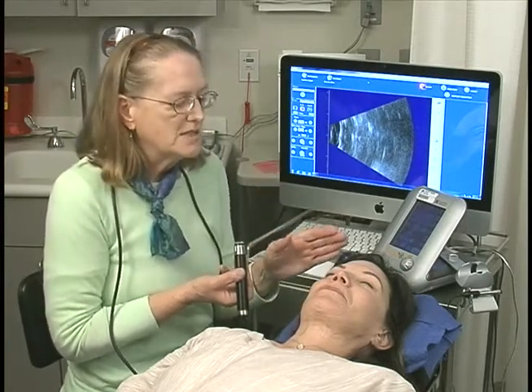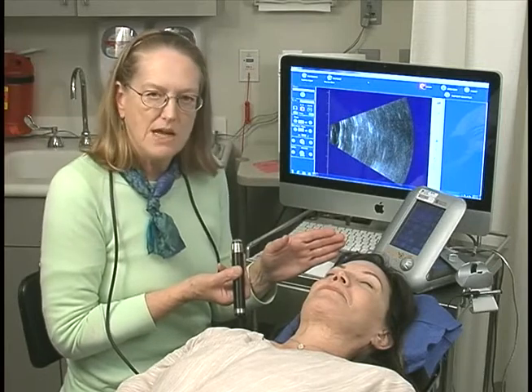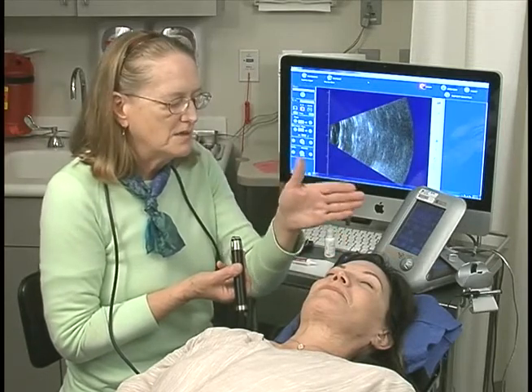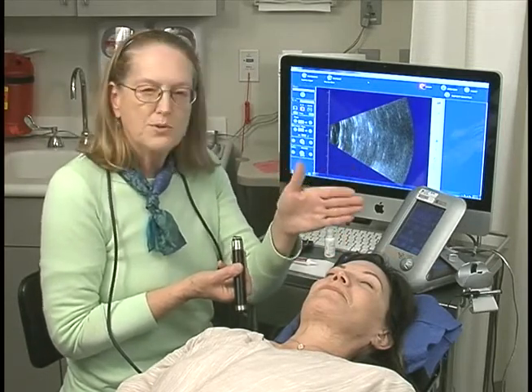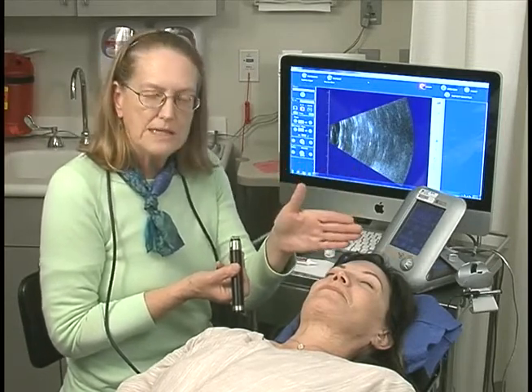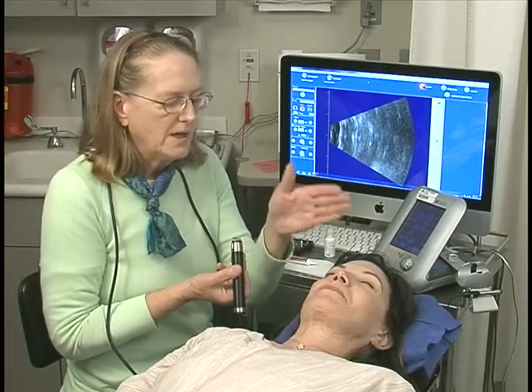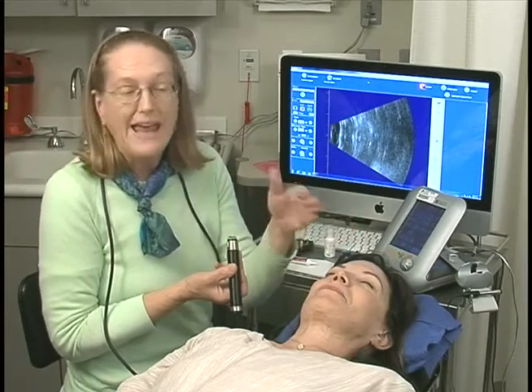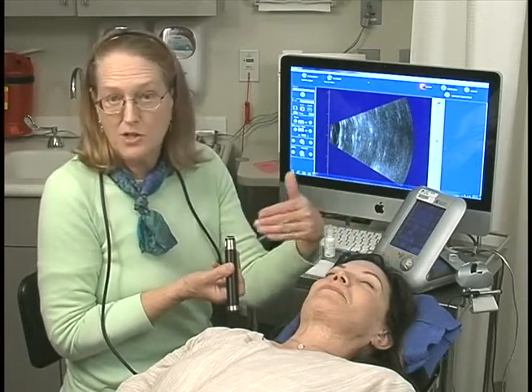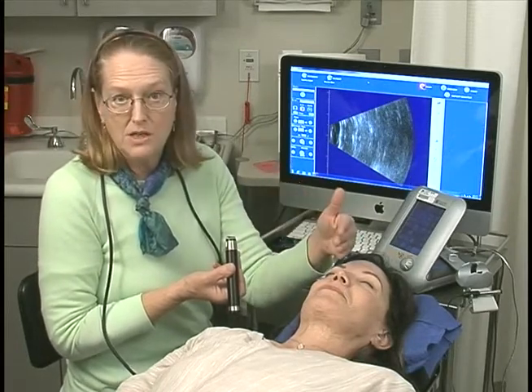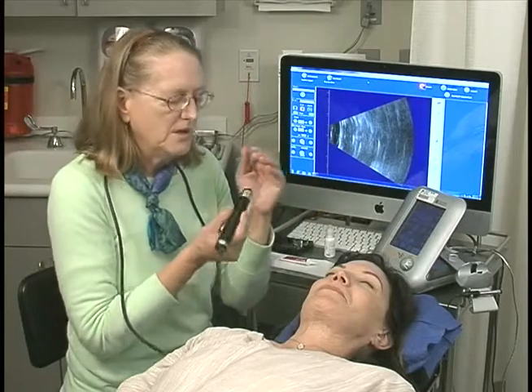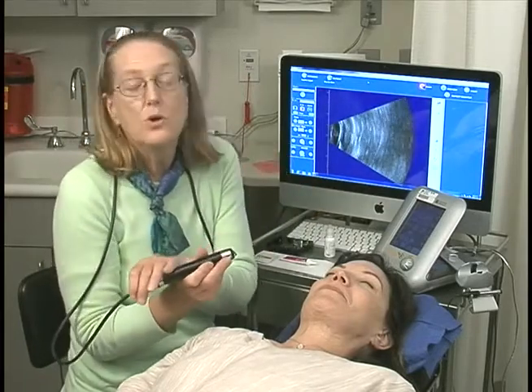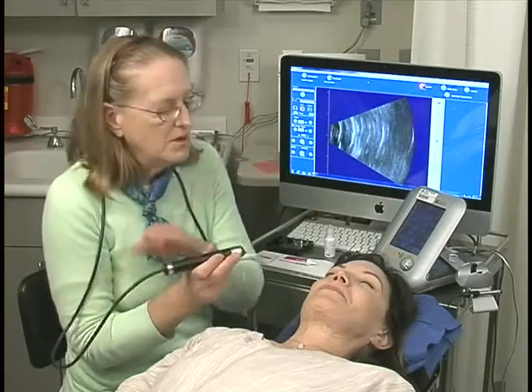But there are times when it's nice to do an axial scan so that we can document the posterior lens capsule in relationship to the optic nerve, and if there's another pathology in that view. So let's start with a horizontal axial — the most useful.